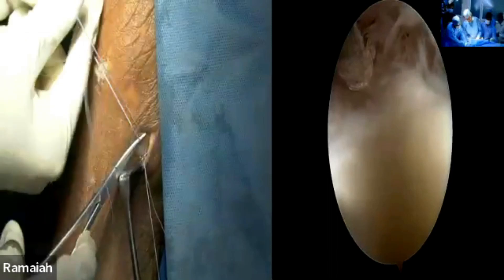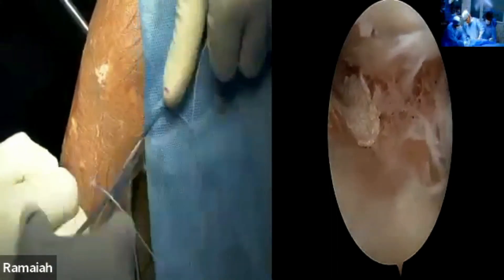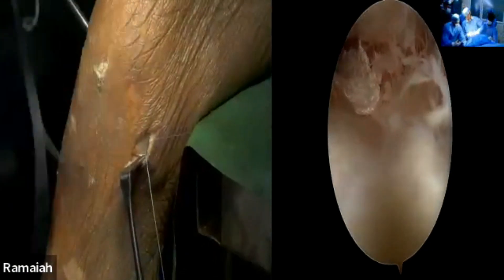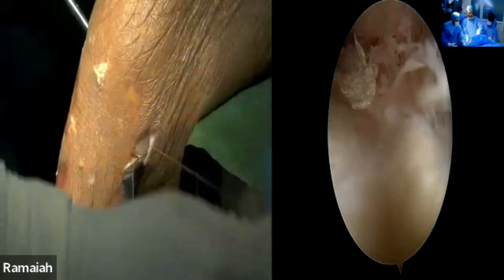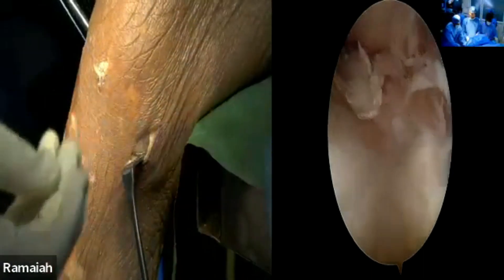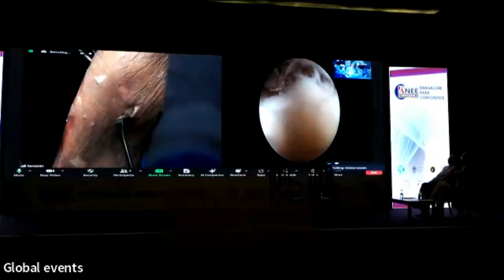Inside-out is the gold standard — Jagadish also mentioned it earlier. Before all-inside came in, we did only inside-out for a lot of patients. It is also very much cost effective — with the cost of one all-inside device, we can actually do multiple repairs here.